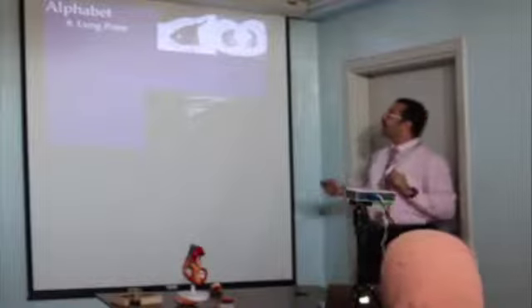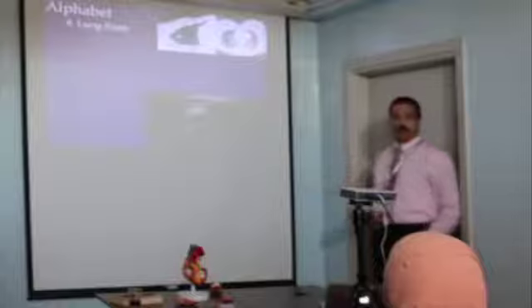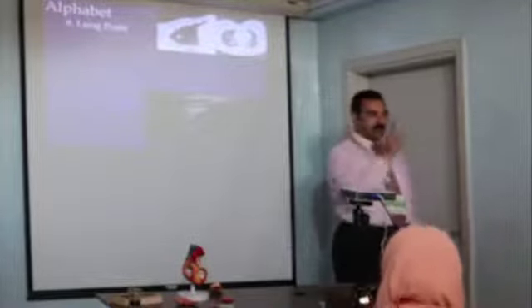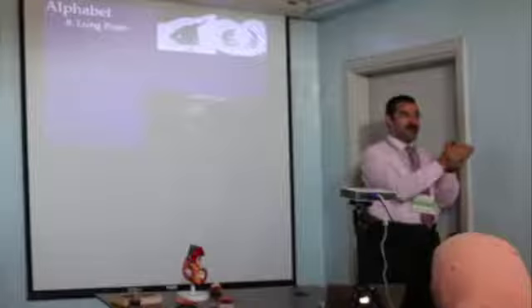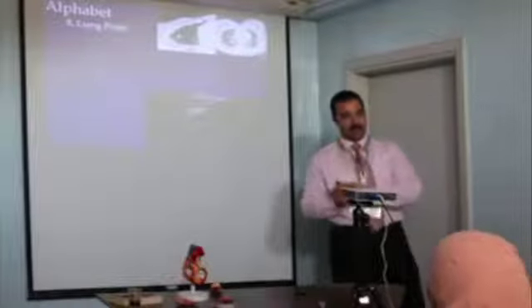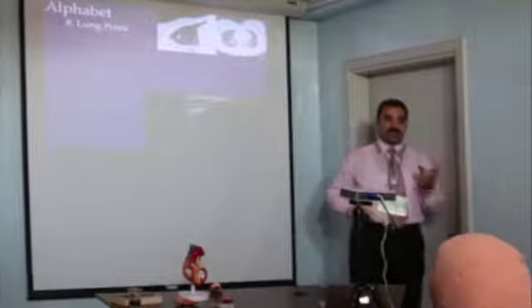There's lung pulse and lung point, totally different expressions. Lung point, this is two CTs. There is a transition zone between the pneumothorax and no air. If I put my ultrasound probe in this zone, I find that part of my probe is covering normal lung tissue, which is showing sliding, and the other part of the probe is showing no sliding. If you pick this point, which is really an expert skill, you can say there is pneumothorax 100% in situ. This is diagnostic in 100%. But it's a difficult one. You cannot easily get it.